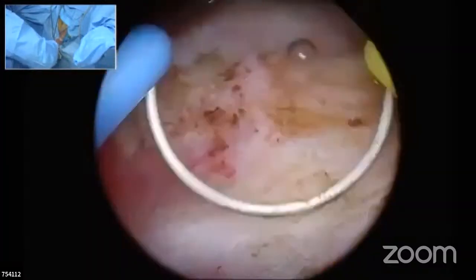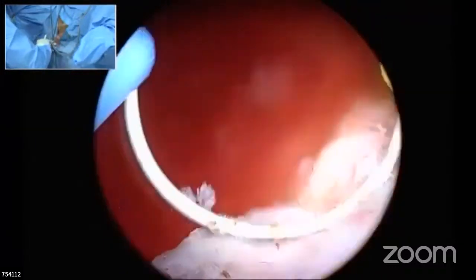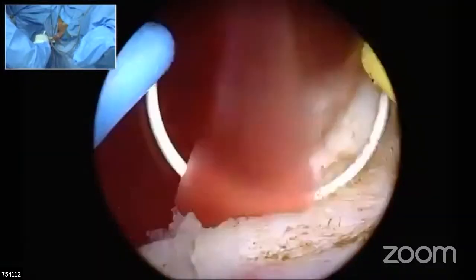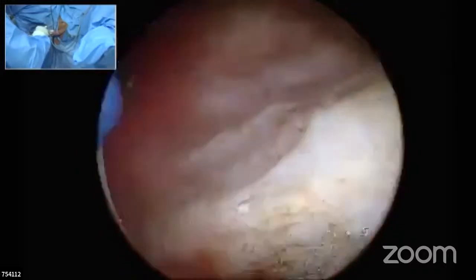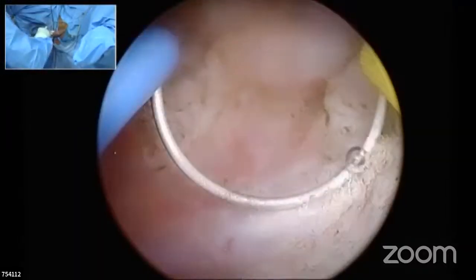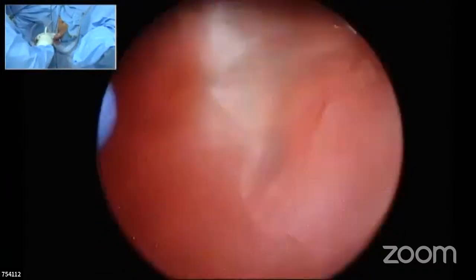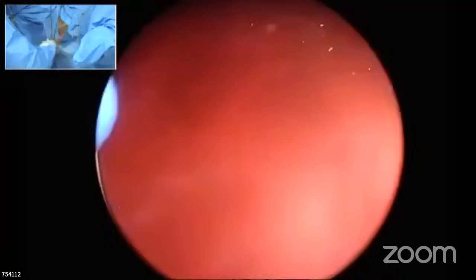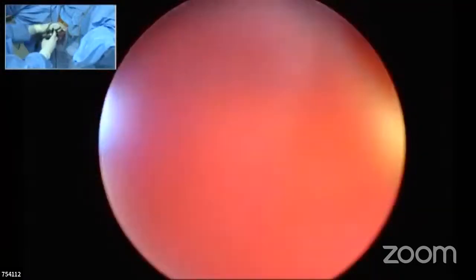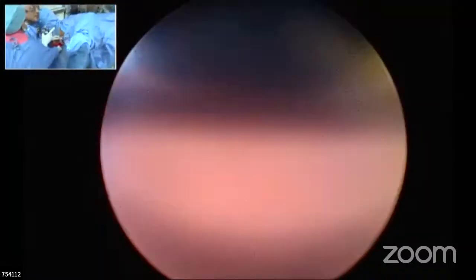In my experience, one of the factors, which Mallikarjun you demonstrated initially, is preservation of the mucosa around the bladder neck. You may remain 1 or 2 millimeters inside on the prostate side instead of resecting on the bladder side. If you resect that mucosa, there are higher chances, because when healing takes place, and this is basic, healing is always by contraction. So you have to make sure that mucosa is preserved there, and I always try to do it. To minimize it, I agree with you. Anybody can have bladder neck contracture. The patient where you don't want it, he will have it, so it always happens.